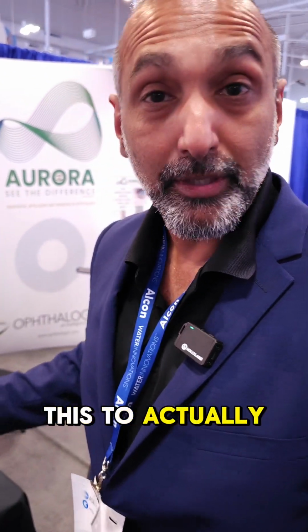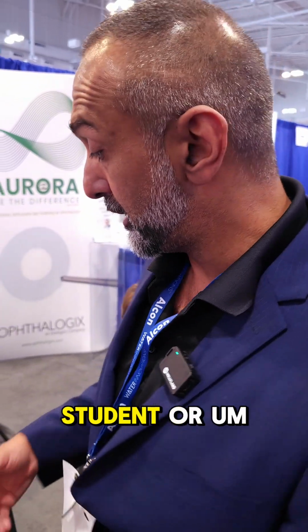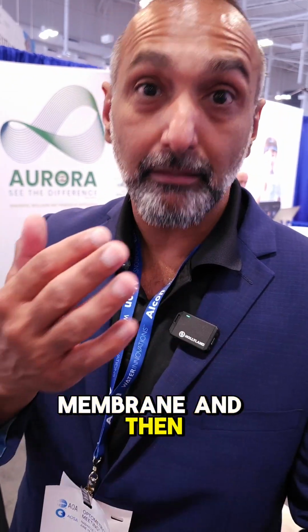I don't want this to actually stick to her eye during a demonstration. So whether you're practicing with a partner, practicing with a student, or just practicing on somebody that you don't really want it to stick to their eye because you're just practicing, put a bandage lens on the eye first. Put a contact lens on the eye first to protect the eye from the membrane, then apply the membrane and then your bandage lens. So it's kind of like a sandwich, but we're doing that just for demonstration purposes. In reality, you wouldn't do it that way. There would be the membrane and then a bandage lens on top.